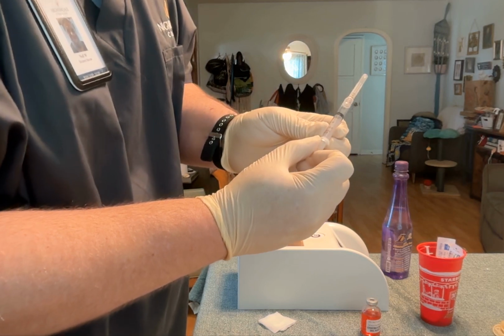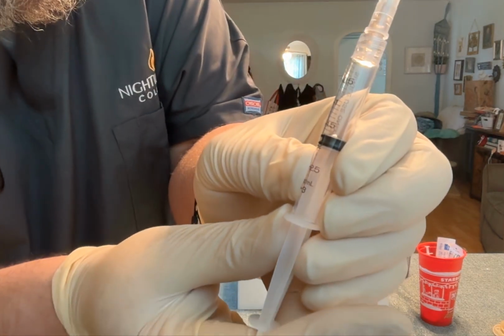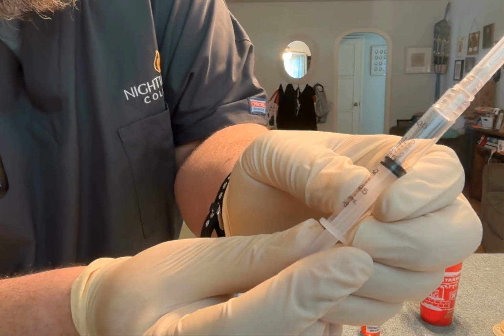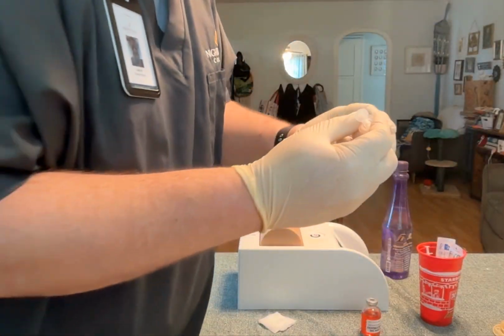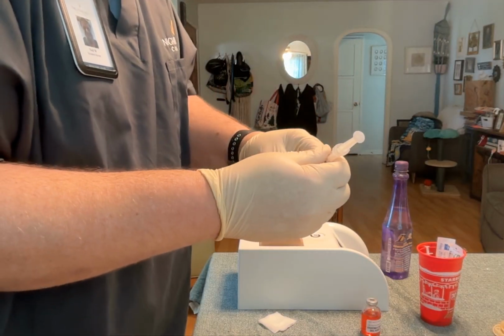Now I've determined that I need 1.5 milliliters of solution. So I'm going to take 1.5 milliliters of air. And I'm going to uncap the needle. Oops.